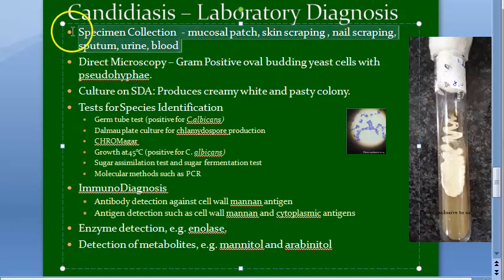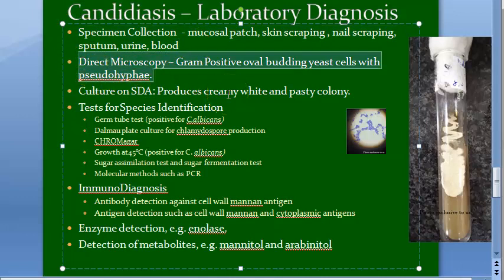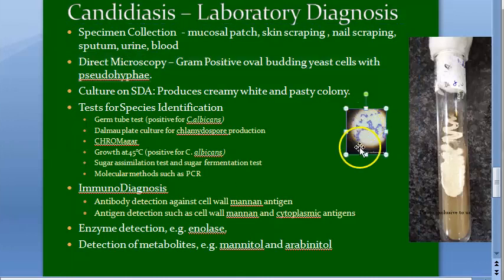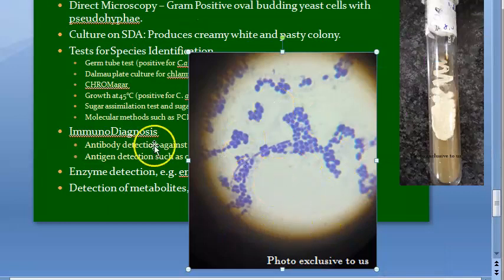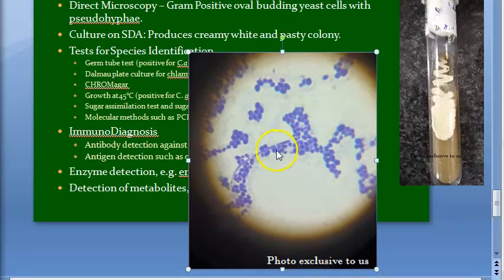In direct microscopy, gram staining reveals gram-positive oval budding yeast cells with pseudohyphae. It looks almost like staphylococci, but staphylococci will not have this kind of continuity — the chain-like appearance you see here is the pseudohyphae.